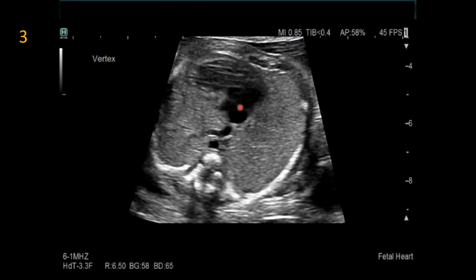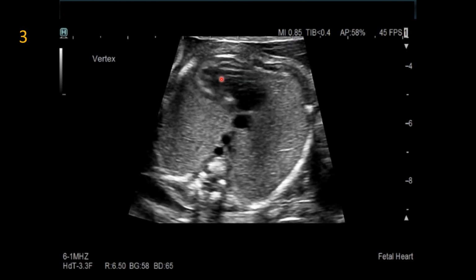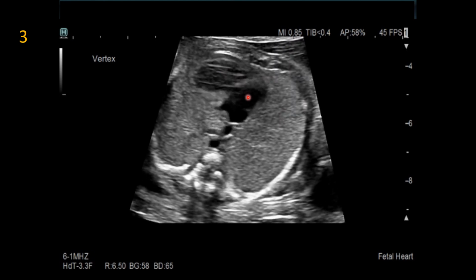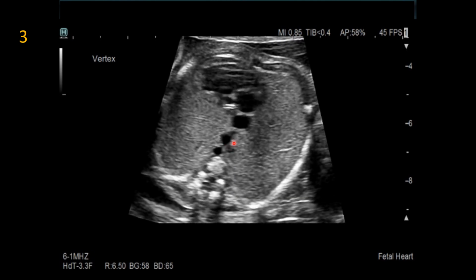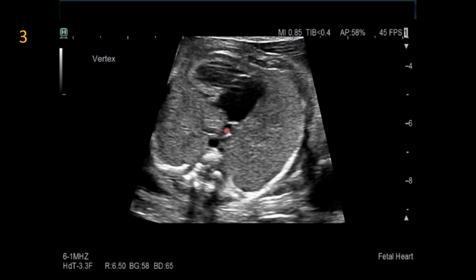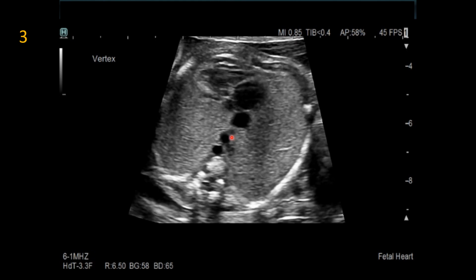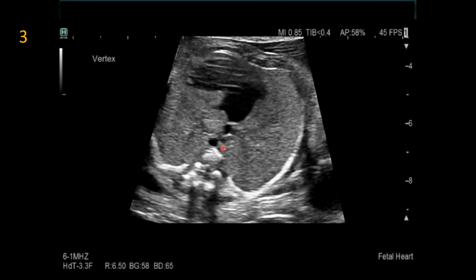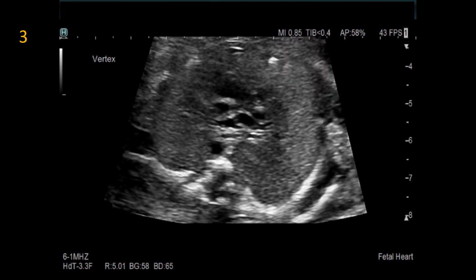the common atrium. Very complex congenital heart defect consisting of a dominant ventricle, so a single ventricle with a common atrium. And then we have this other structure here, which is not supposed to be there, a venous structure anterior to the aorta, but posterior to the IVC, in between the IVC and the aorta, and we'll see what that structure is. But first, we're going to sweep to the top of the chest, and so this is very high in the chest. This is above the great vessels here in the upper chest.